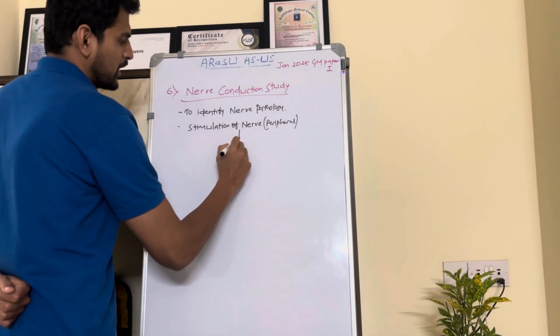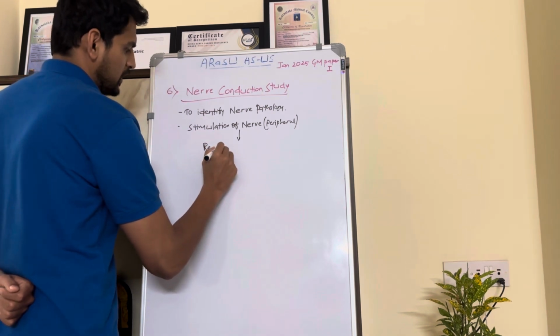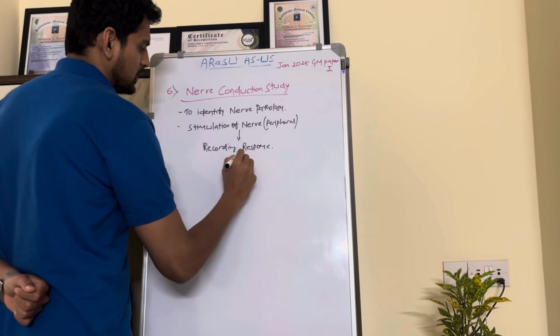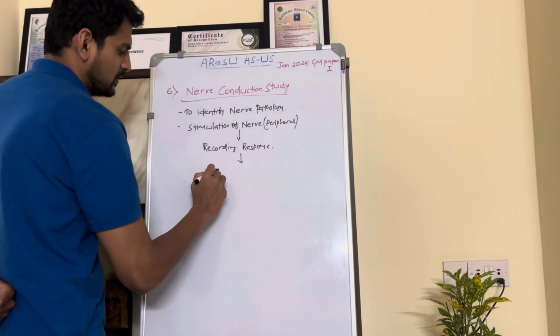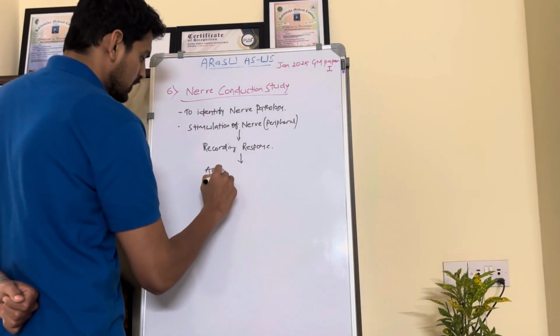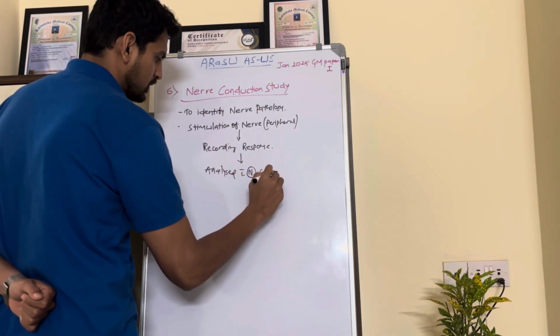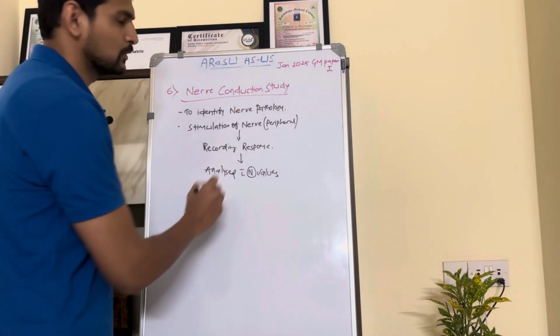After stimulation they will record the response, then it will be analyzed by comparing with normal values, to find out the pathology proper.